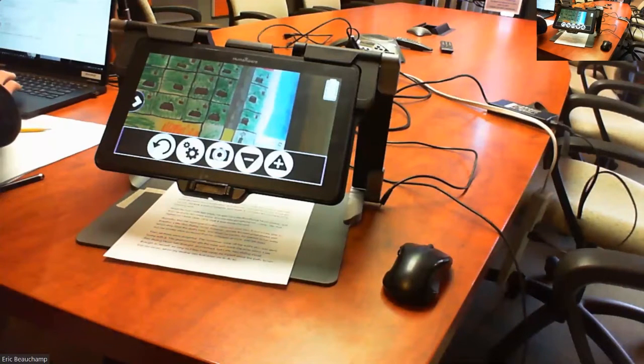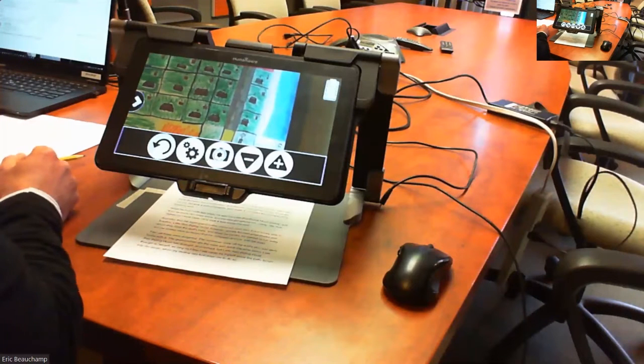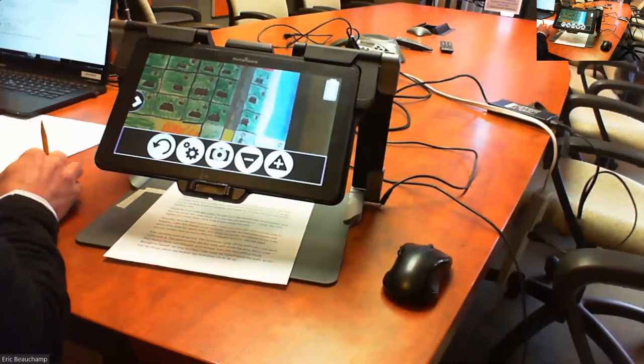I have a lot of problem with the distance camera. The battery does not last long for my student. I sent the battery in for HumanWare. They said it works fine. How long is it supposed to last?